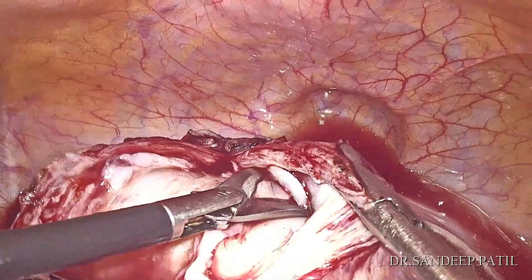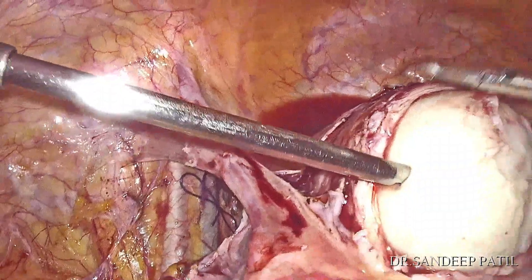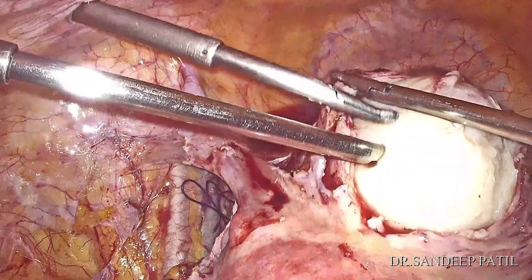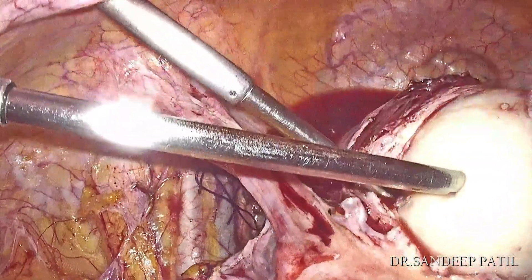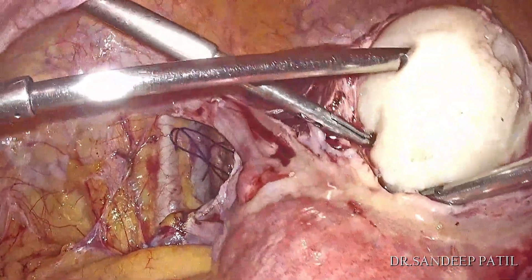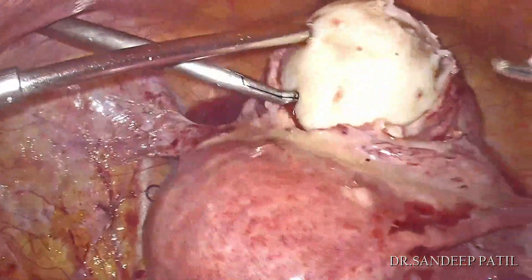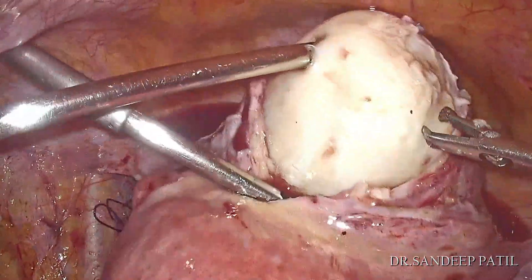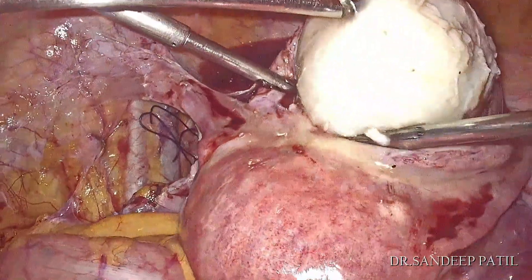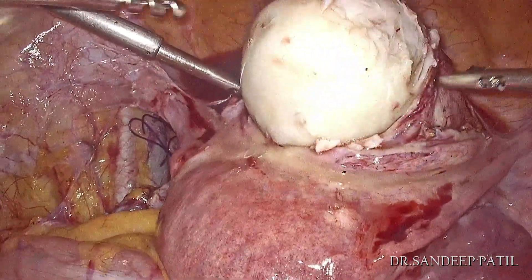This incision should always be vertical midline and not transverse. If we take a transverse incision and if it extends either deliberately or accidentally, it may damage the ureters.